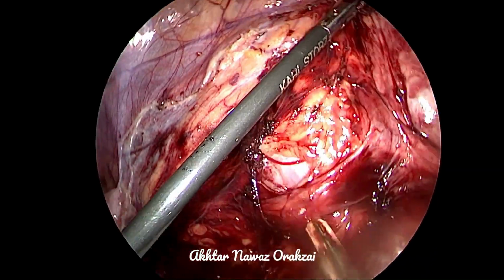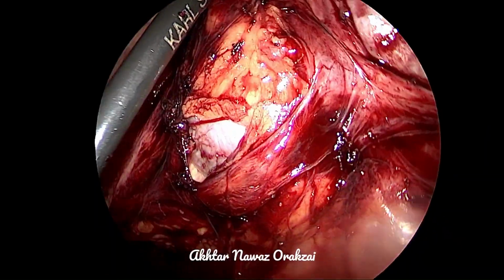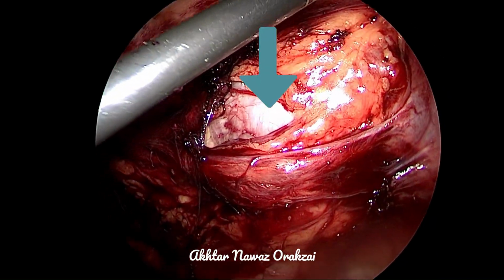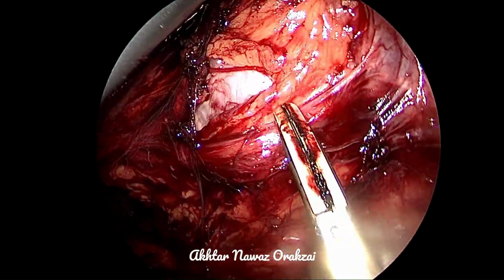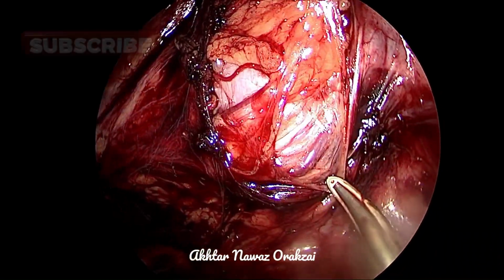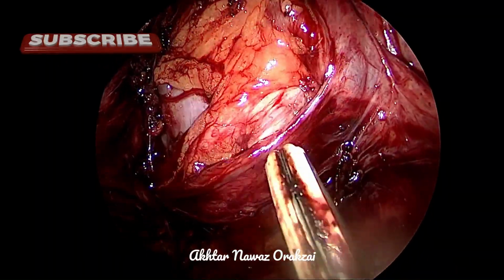So we are trying to find the ureter here. The lower pole of the kidney has started showing up, and we look for it, and we see that there is a peristaltic movement in the fat behind the vein, the gonadal vein. So we are now sure that this is the ureter. Yes, this is the ureter, and we can dissect it.